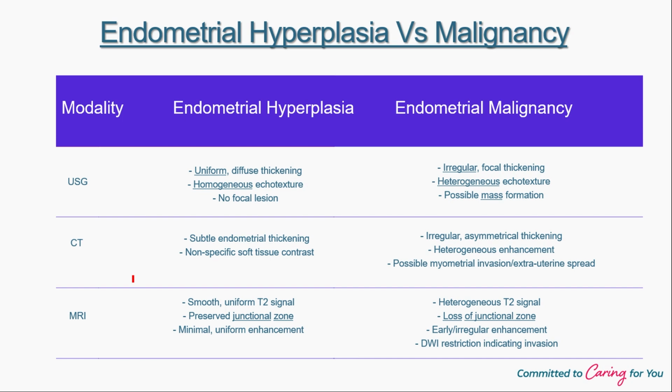What happens is that most tumors, as you know, as they grow, start to get their own blood supply, what you call angioneogenesis. So this property is exploited by imaging. When there is angioneogenesis, which is the new blood supply formed by the tumor itself, the Doppler signals can be picked up. The Doppler shows bright signals. In the same way, the contrast also enhances more in the tumor because of this angioneogenesis where new blood vessels are formed. And also the tumor cells are closely compacted, so the diffusion of water between the cells doesn't happen. So this property is exploited in MRI diffusion studies.